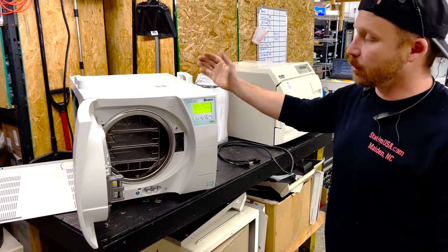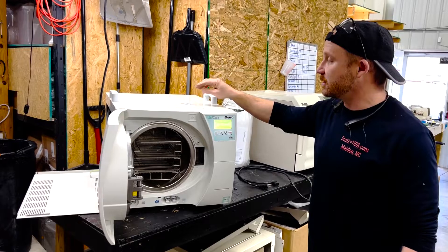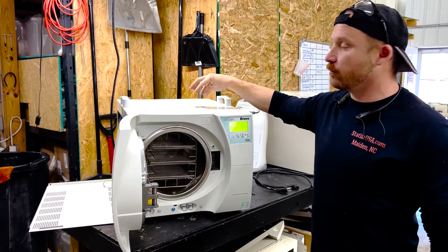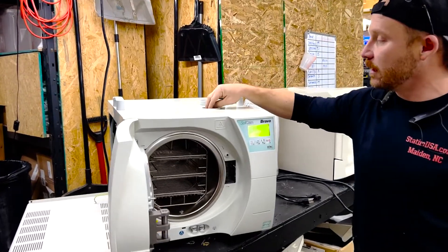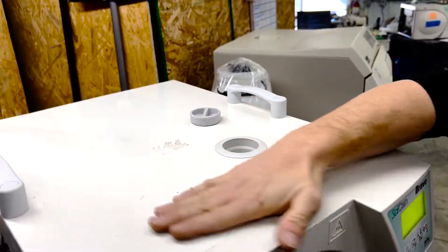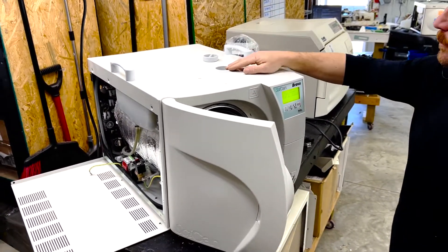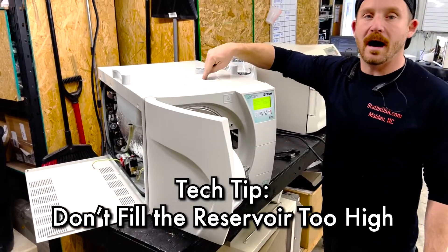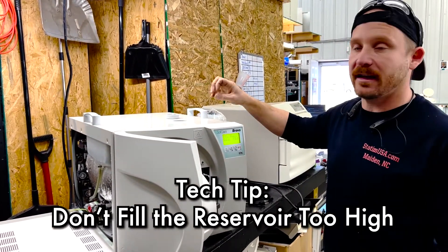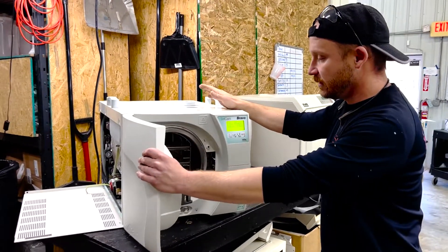It was brought in from Winston-Salem, North Carolina for repair. The customer was reporting that there was bubbling, or that the reservoir — this is the reservoir right here — was overflowing, and I definitely experienced that. It is not an actual malfunction of the machine. But if you fill the water up too high on this reservoir, then when it starts to create the vacuum, it will bubble back. So this doesn't have a defect.